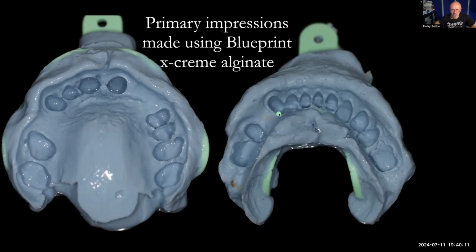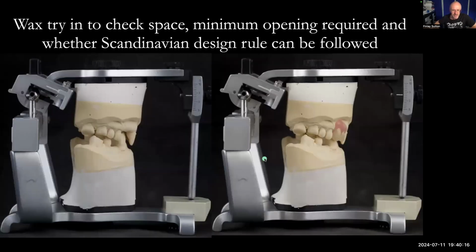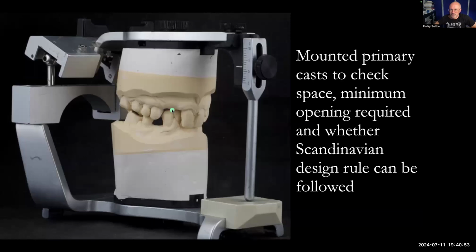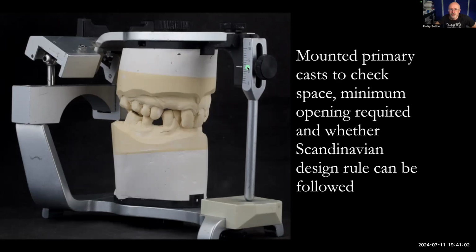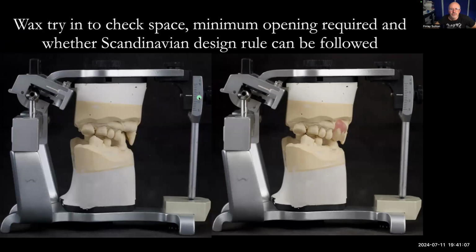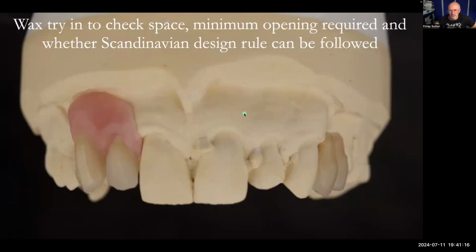But I did that. And then what I got Rowan to do is to mount these casts on the articulator like that. Because what I wanted to do specifically was to see how much space we have if we open the jaw up and open the bite up there, number one, to get teeth in, and B, to see where we would need the metal bite surface on the lingual aspect of these teeth. That was that there. You can look how tight that is with it closed down. And then this is it with it open. Closed down, if you look at the number on the pin there, it's 2 millimeters on that pin. And then 1, 2, 3. This is about 2.5 millimeters jacked open from the normal bite position just here. So Rowan did this wax up there like that.